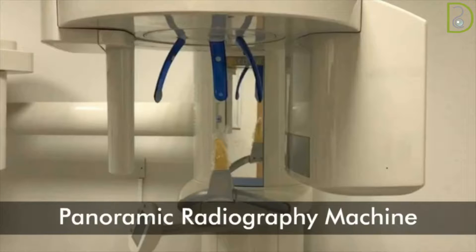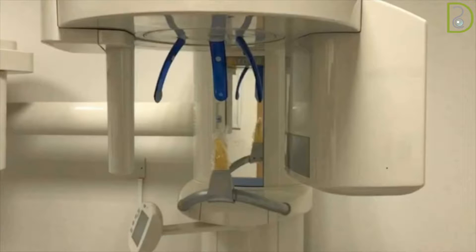Hello everyone, this is a quick video on how to take panoramic x-rays. Positioning techniques vary from one machine to another; however, there are some general requirements that are common.